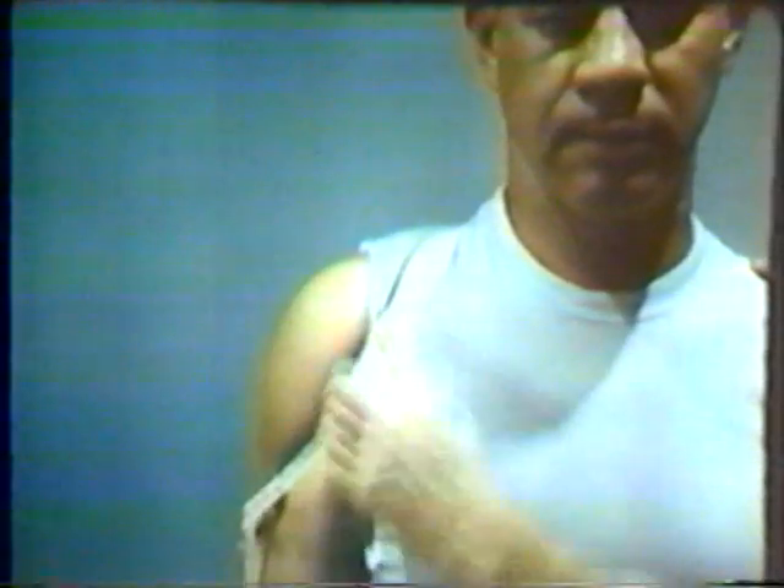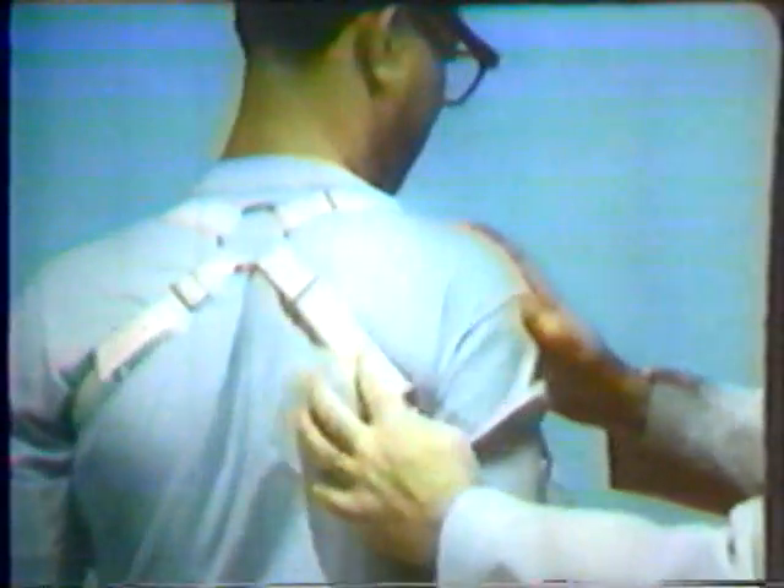The anterior support strap should pass through the deltopectoral groove, and the inverted Y should be provided with buckles for adjustability. The primary function of the anterior support strap is to provide stability against a downward pull. The third major component of the below-elbow harness is the control attachment strap. Originating at the ring, the control attachment strap passes below mid-scapular level, is attached to the control cable, and looped back through a buckle for adjustability. In effect, the control attachment strap is an integral part of the control cable system of the below-elbow prosthesis.